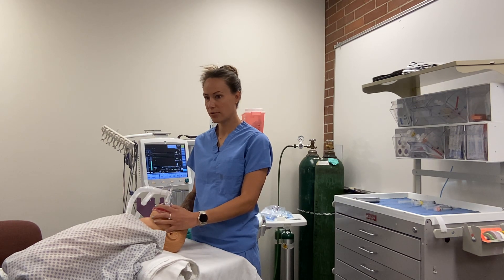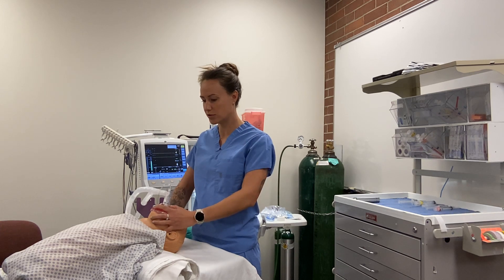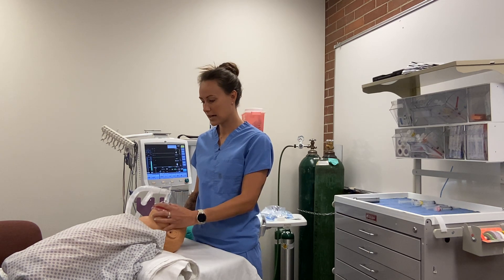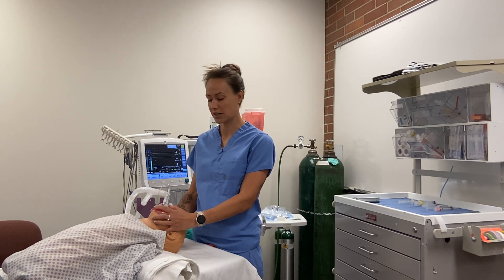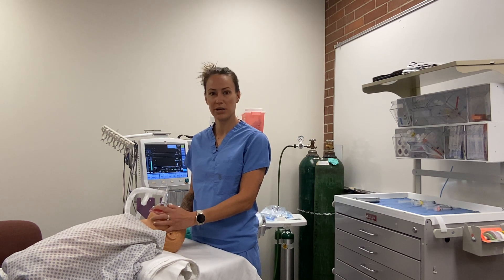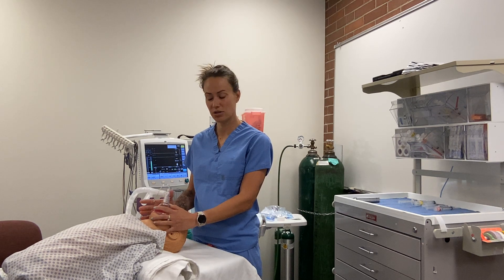The patient is progressing through Stage 2, so we hold on. The patient may have uncontrolled muscle movements; if we looked at their eyes they would have a disconjugate gaze. They may fight a little more, blood pressure might go up, and they could be tachycardic. We just hold on to get through this stage. Once the patient starts to calm down and respirations go into a more regular pattern, we know we are entering Stage 3 — surgical anesthesia — where we want to be.